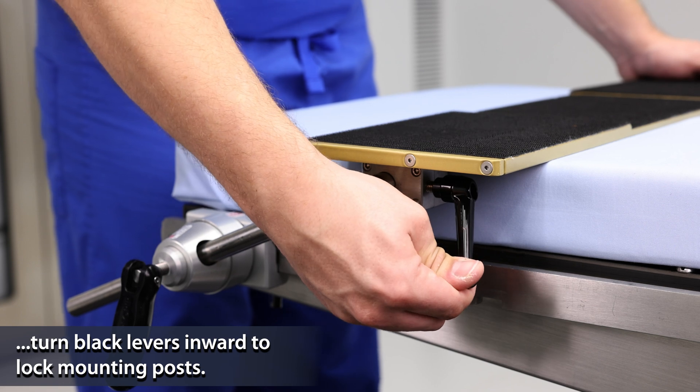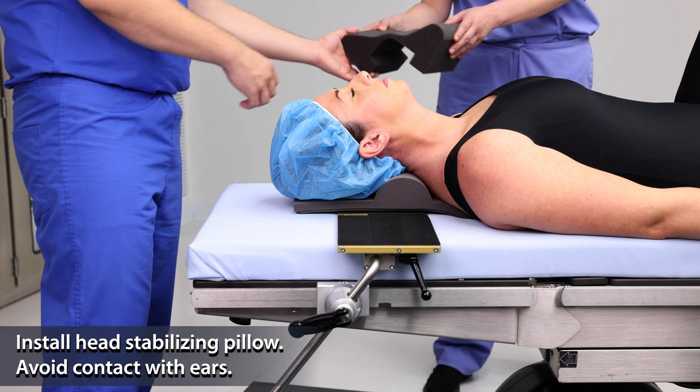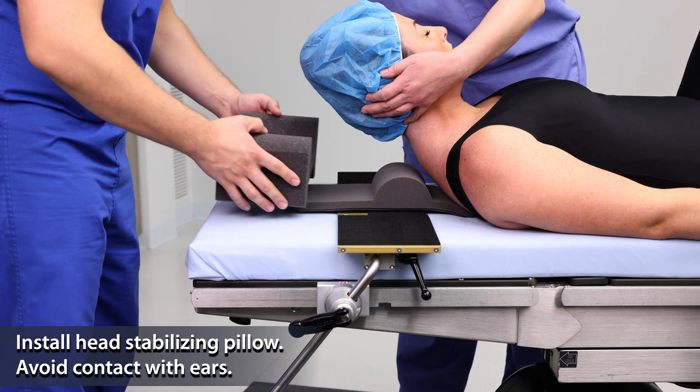Turn the black levers inward to lock the angle of the mounting posts. Install the head stabilizing pillow and take care to avoid contact with the patient's ears.